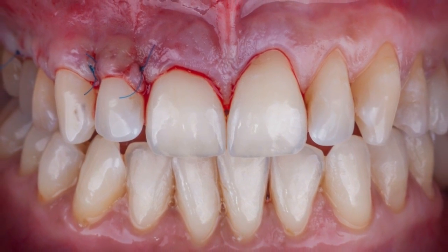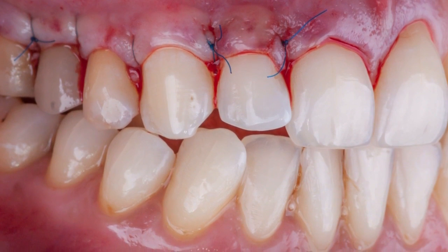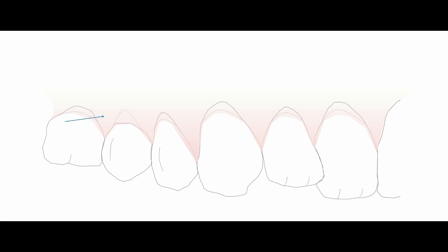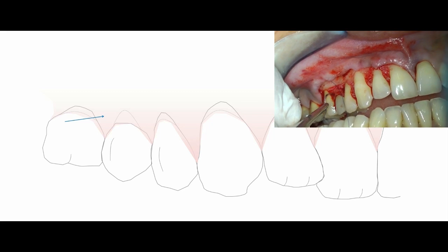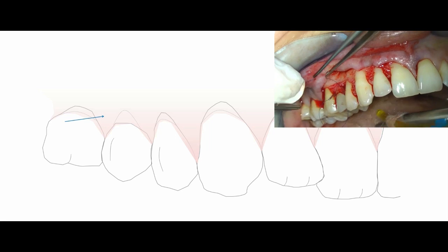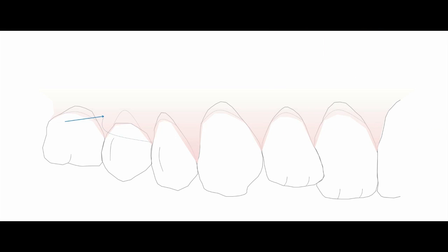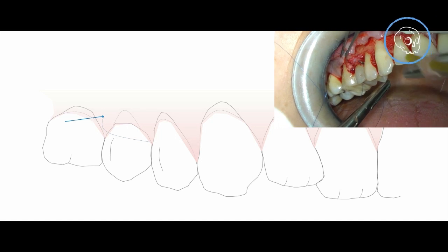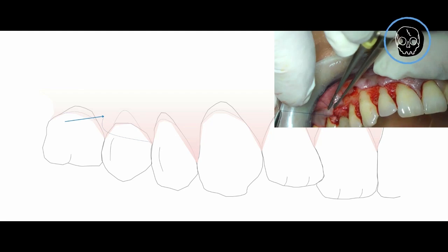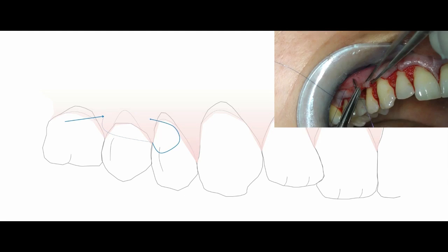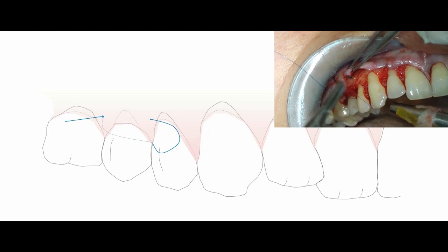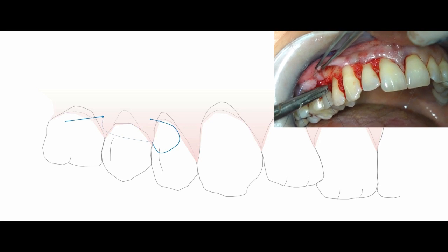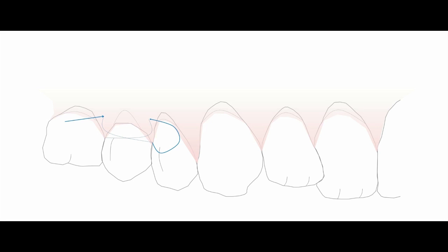We are now ready to suture. The first area to be sutured is the most distal. The needle will enter from vestibular on the distal papilla, passing through both the anatomical and surgical papilla connecting them, then exits on the palatal side. It is transported mesially to the mesial papilla and passed from palatal to vestibular through the interdental space using the back of the needle. The needle will then re-enter vestibularly on the mesial papilla and similarly exit palatally, then be transported distally, passed to the vestibular side using the back of the needle, and the knot tied where we started.